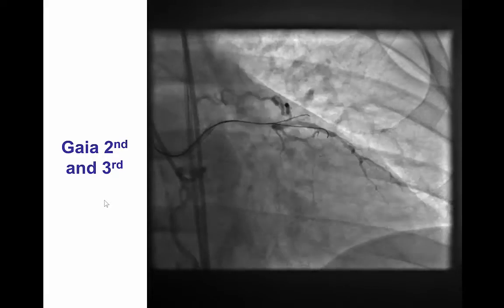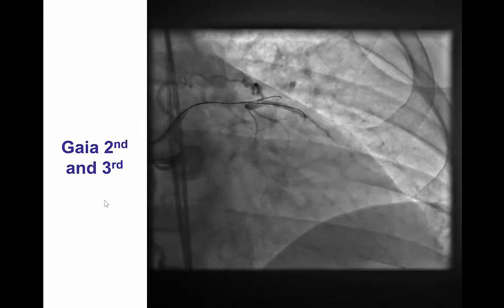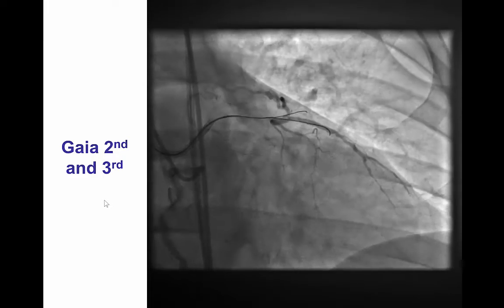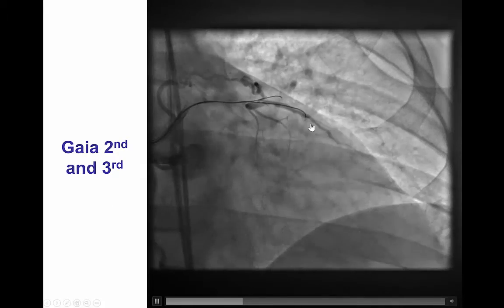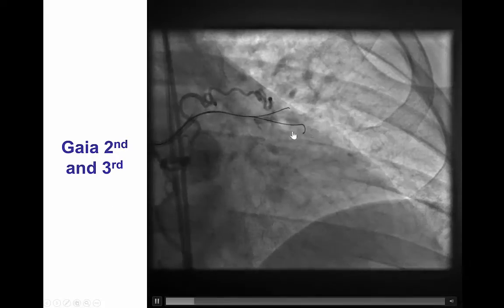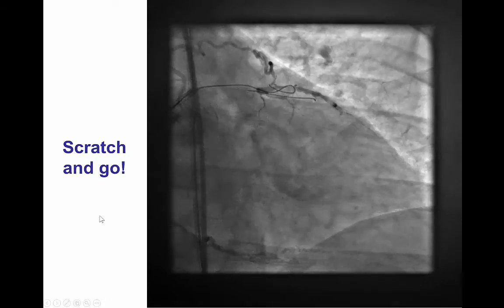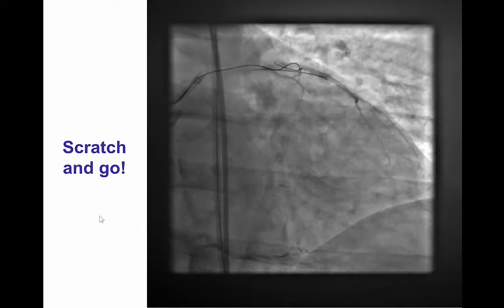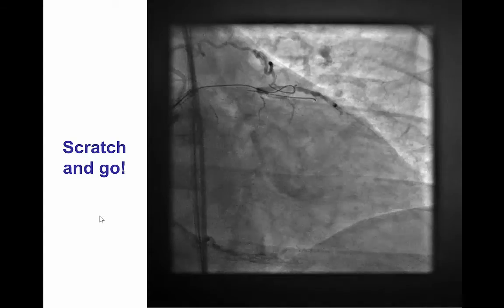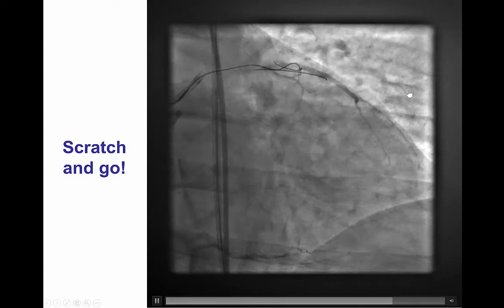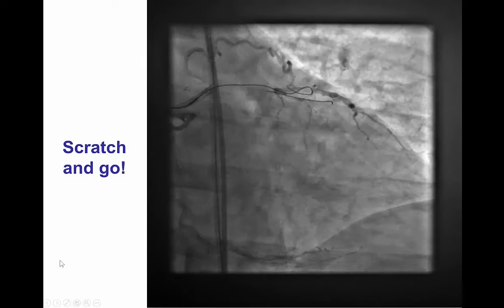We performed intravascular ultrasound to define the proximal cap and then attempted guide wire escalation using a Gaia second and third. However, the wire is clearly not in the vessel structure and is not tracking with the vessel. We were then able to create a dissection at the ostium of the proximal LAD and, by doing that, advance a knuckled guide wire into the proximal LAD.